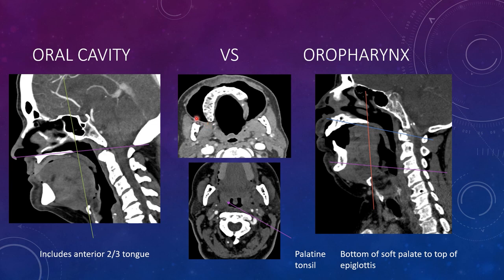On CT imaging with a puff cheek technique, this is the retromolar trigone. This is considered part of the oral cavity — it's lined by just mucosa and vessels, so it's a great place for secondary spread of neoplasm or infection. Here is the retromolar trigone, right and left.